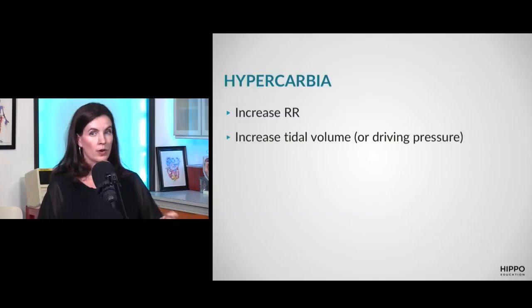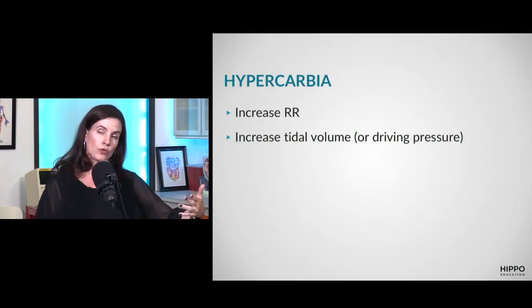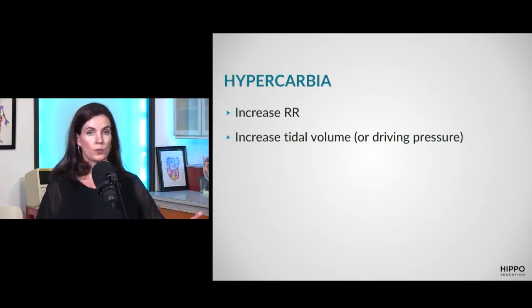This is where the respiratory rate and tidal volume come in. Exactly. So this is where you want them to breathe harder and faster, because that's going to allow them to blow off more CO2. So we're adjusting either the respiratory rate to turn it up, or you're increasing your tidal volume if you've set volume control, or your driving pressure if you've set pressure control.